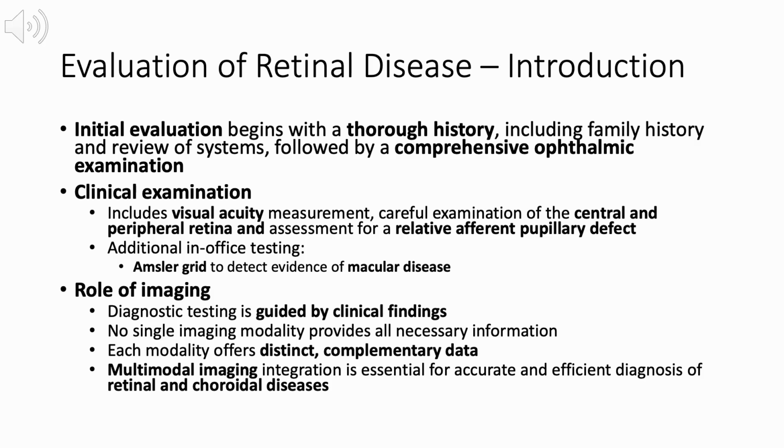Building on the clinical examination, imaging plays a central role in diagnosis. Diagnostic testing is guided by clinical findings, as no single imaging modality provides all necessary information. Instead, each modality contributes distinct and complementary data. For this reason, integration of multimodal imaging is essential for achieving an accurate and efficient diagnosis of retinal and choroidal diseases.